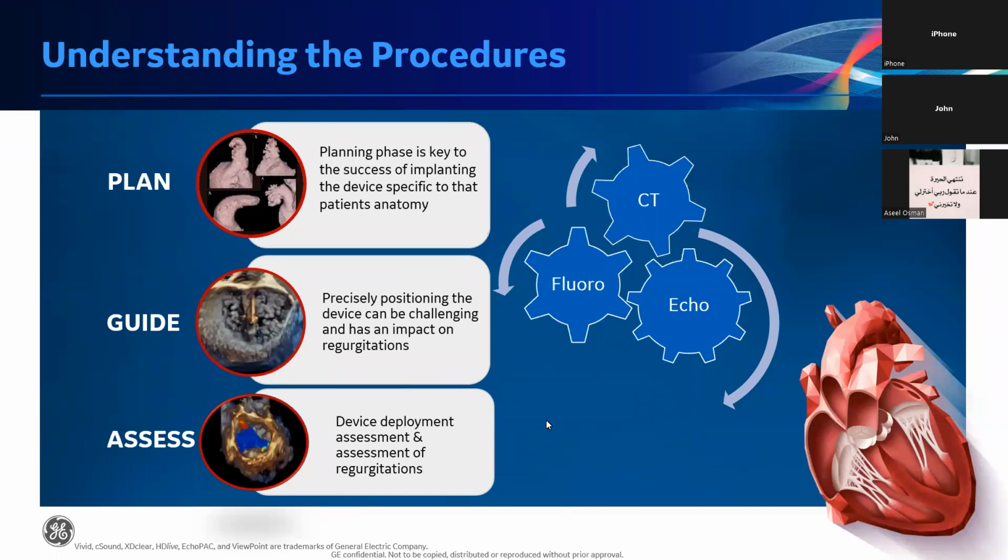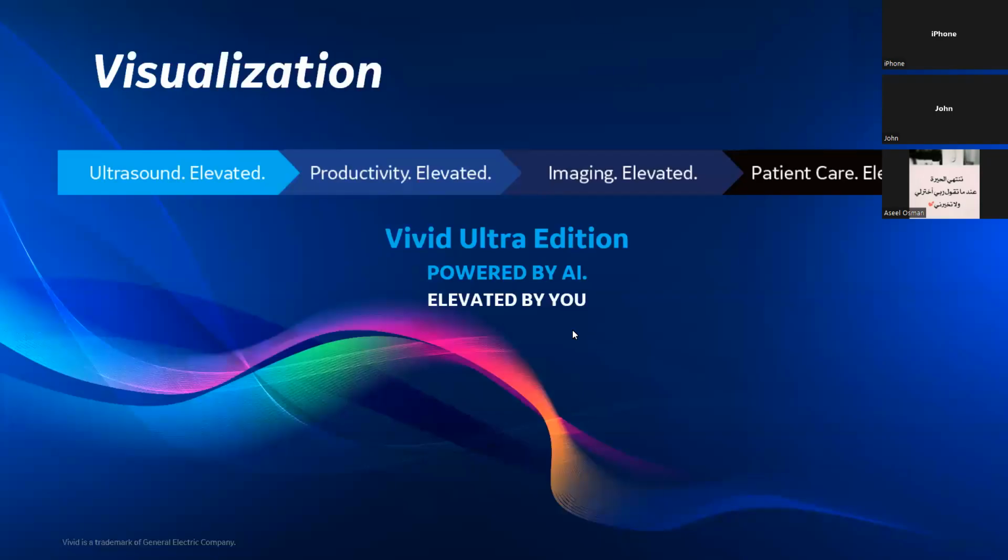Is there a residual regurgitation? Is there a caused stenosis or a secondary stenosis due to too many clips, for example, in a mitral valve clip? So again, different imaging modalities can help in that aspect. So what about echo? Of course, since we are talking about 4D echo tools and how they can help, we can help in 3 aspects: visualization, navigation, and of course, quantification.